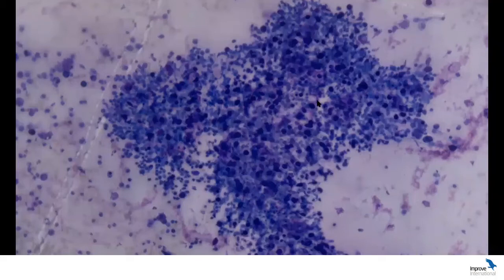This is something that I want to reinforce, is that we have absolutely to look at the whole slide with a low magnification, identify the different areas of interest, and then move on to the oil, and not just go straight in. Okay, it's a common mistake to go straight into the oil magnification, and you're going to miss out on important information. And that was the case certainly for some of you.